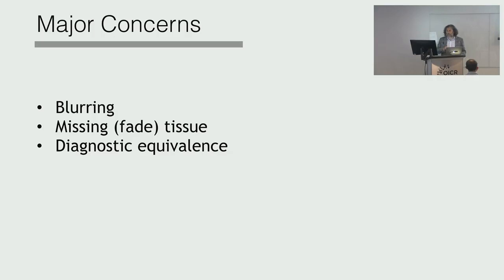We cannot afford that. And this is one of the things that every single company in the field is working day and night to make sure does not happen. Because if this happens, that diminishes the value of digital pathology. But by far, the most serious concern is diagnostic equivalence.